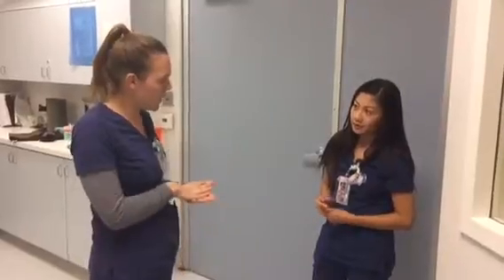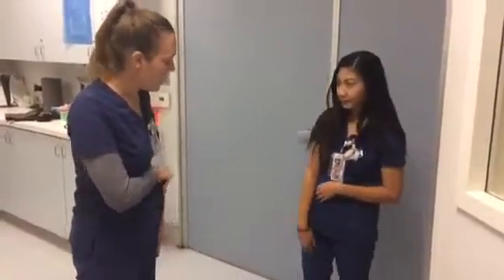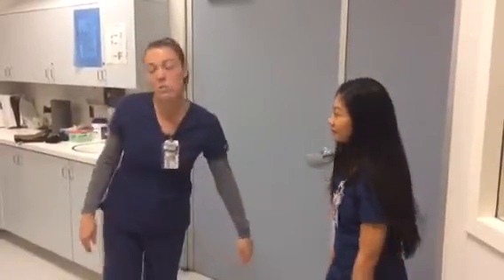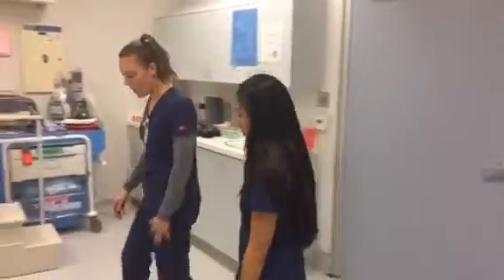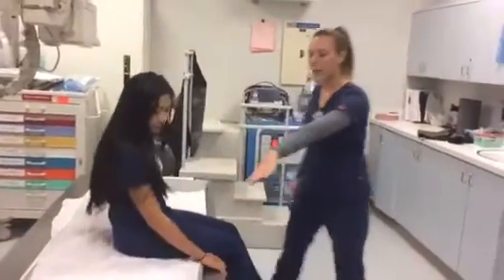So we're going to be doing some knee X-rays. Which knee hurts? My right knee. Your right knee. Okay. And when did this occur? A week ago. A week ago? Okay. So come on in. You can take a seat on the table and lay down.